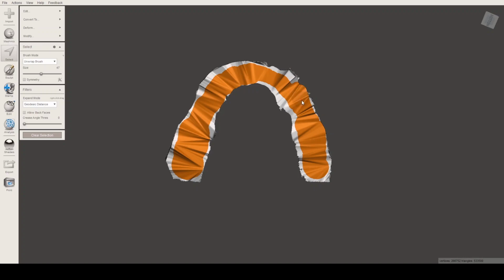Now I wanna select the edges as well. Ah, that was an overlap. I hope when we extrude it, it won't extend on that part. But I bet it will. It's okay. We can always erase it. Just be really careful on this part when you're extruding, because we don't want to double our work. I'm not being careful right now. I'm just winging it. Anyway, let's not be too hard on ourselves. We can make mistakes as long as we learn from it. If we keep making the same mistake, that could be a problem.